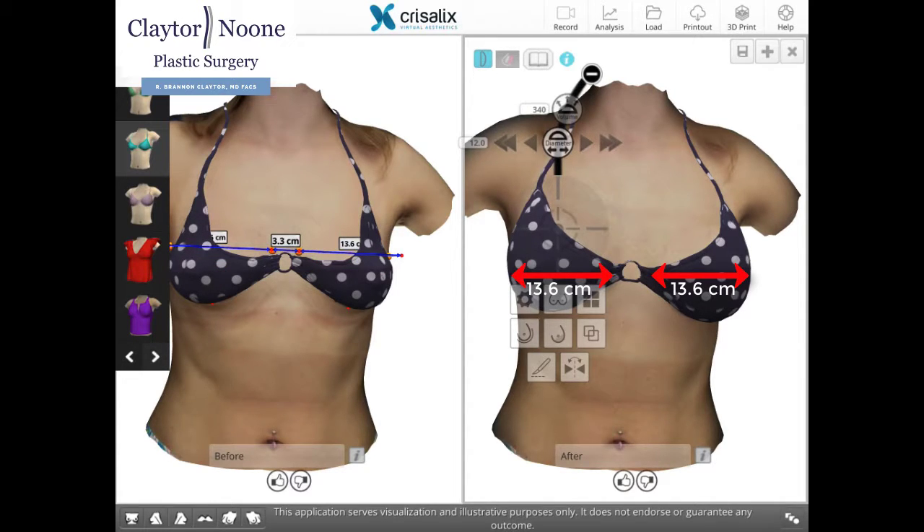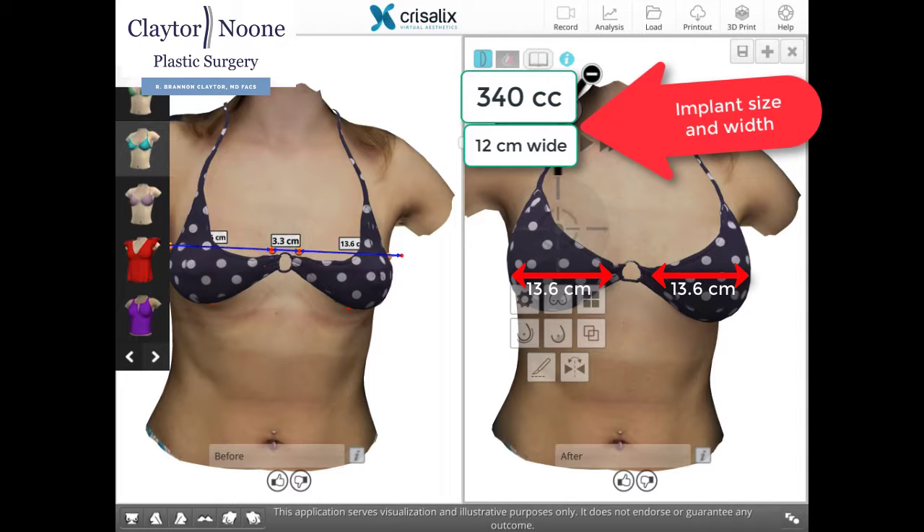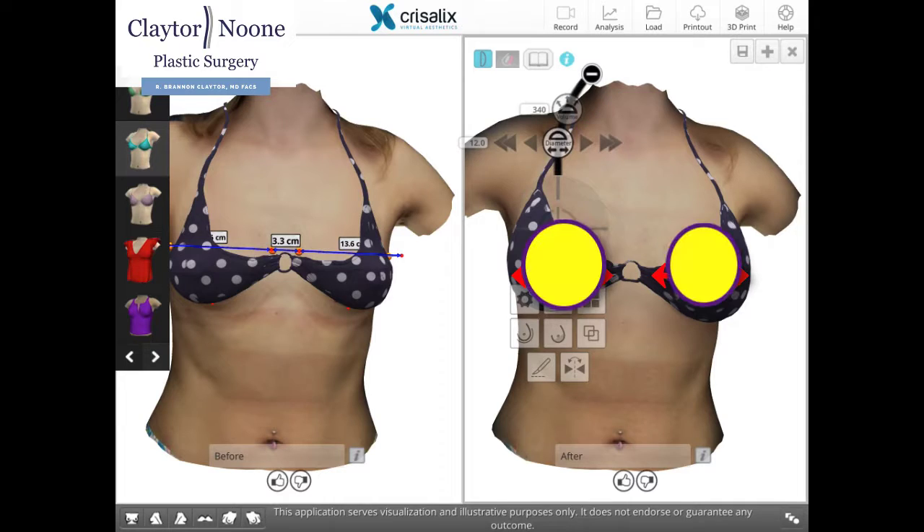Optimally, the implant base width is smaller than the footprint of the breast. This allows the implant to nestle within the borders of the breast and avoid the implant bulging out from the bikini.